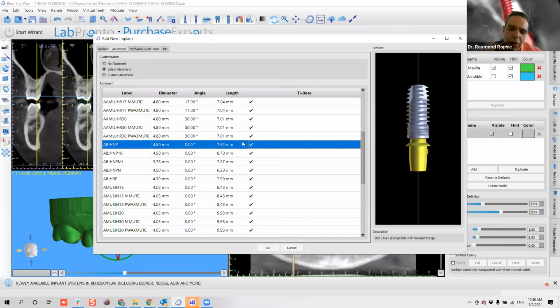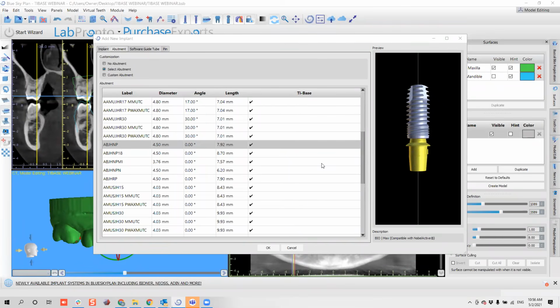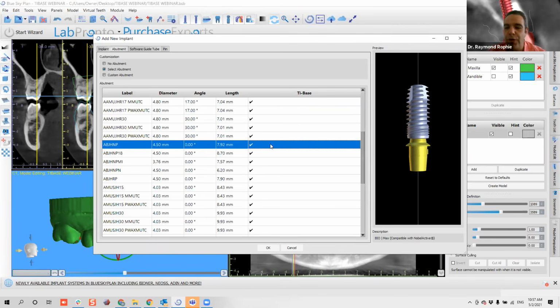And there are more libraries coming soon. Is that right, Michael? Yeah, definitely. In terms of the implant parts, I think we have over 50 libraries now, and the prosthetics are growing rapidly. So we have a whole bunch of systems now, and we're adding the prosthetic parts for different systems on a weekly or bi-weekly basis. So yeah, it'll be really interesting if the implant brand that you're using can get in touch with us. It will be really easy. It's a very, very efficient way to do it.